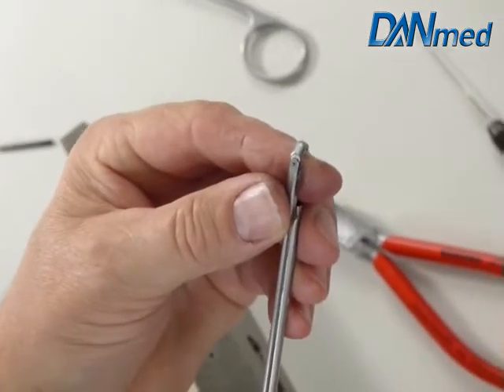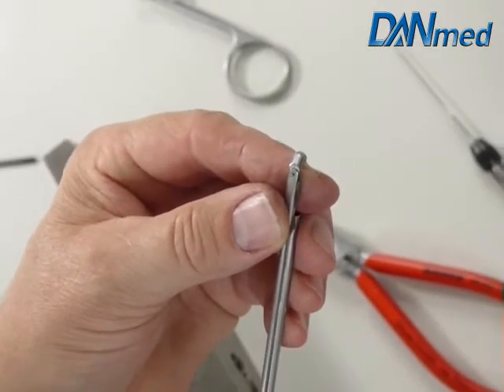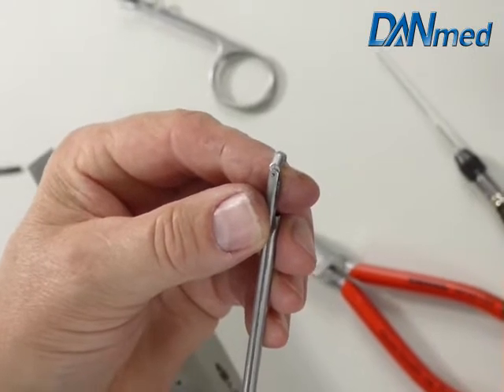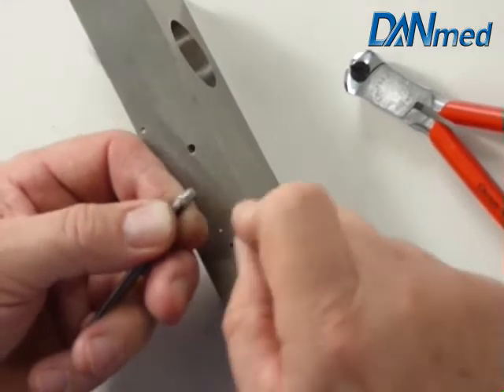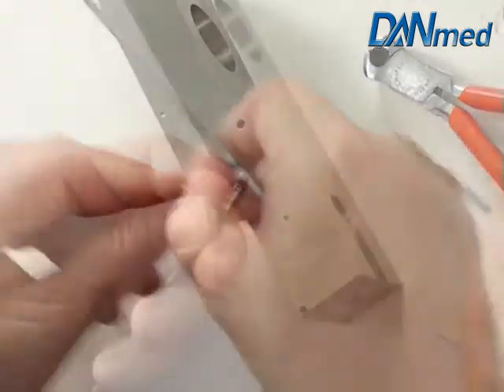If you have a laser you can laser weld this pin, or we hammer a head on the pin on the top and on the bottom side. We're going to flat the top of the pin to make sure that the head is smooth and equal.